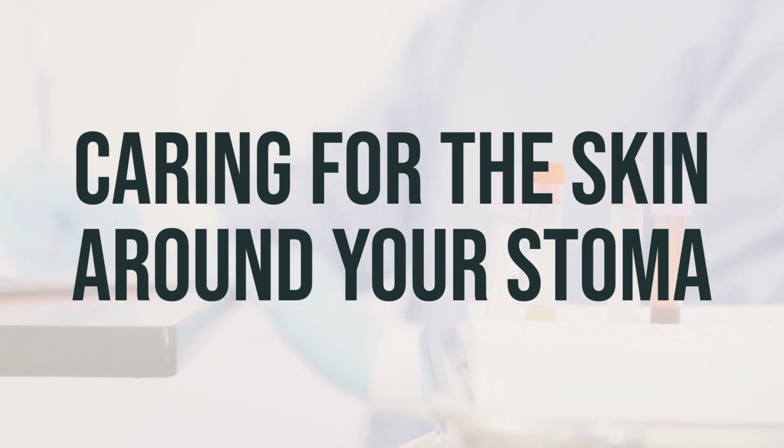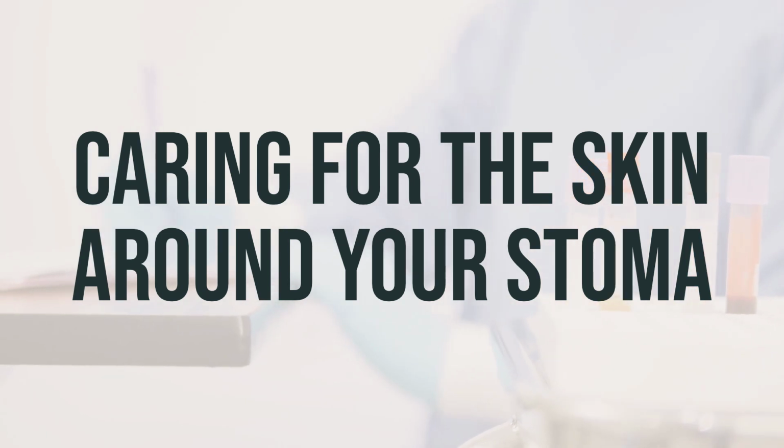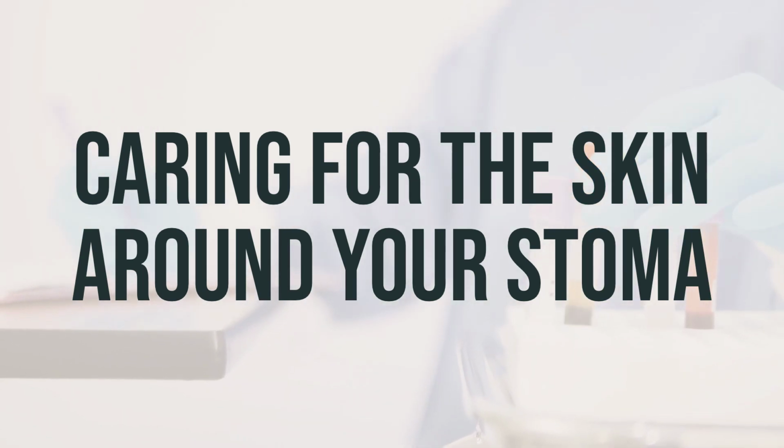You can shower with your stoma pouch on or off, but if you have an ileostomy, you may need to keep your pouch on. Your doctor can provide guidance on this. If you take a bath, it's recommended to keep your pouch on.